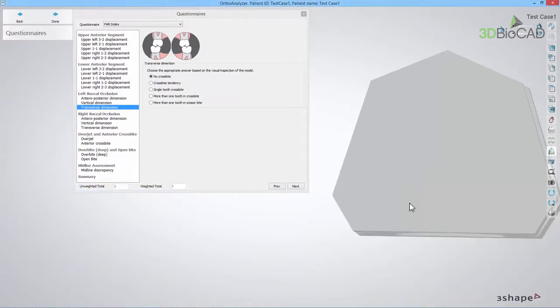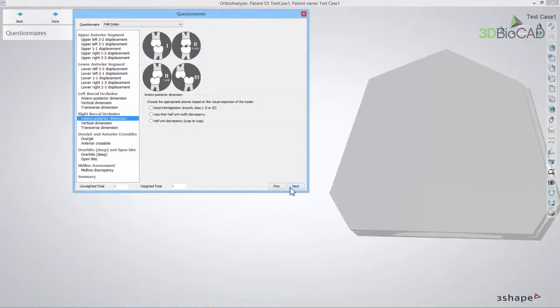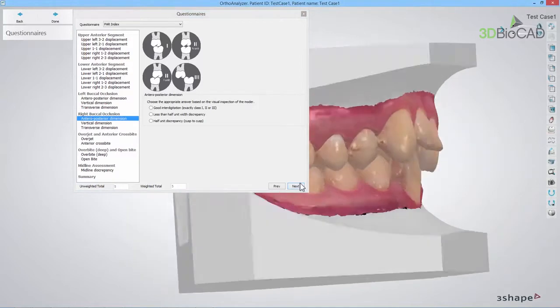When the Left Buccal Occlusion is done, the same procedure is repeated with the Right Buccal Occlusion.